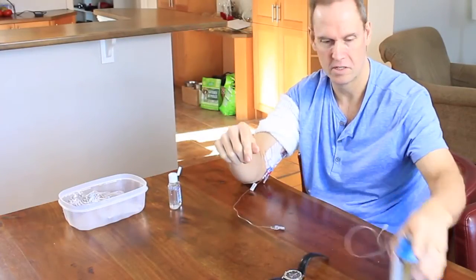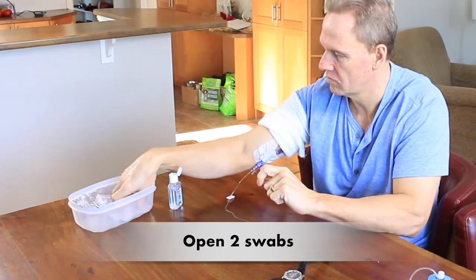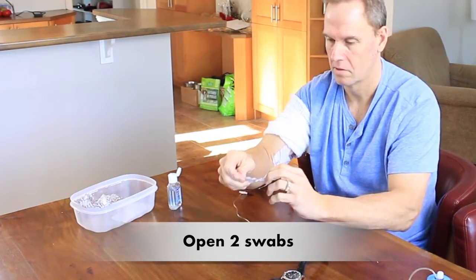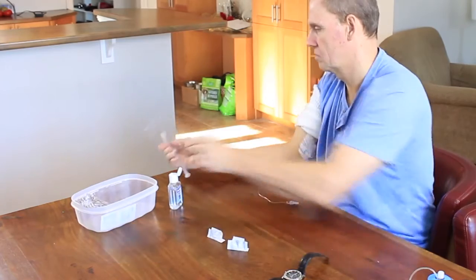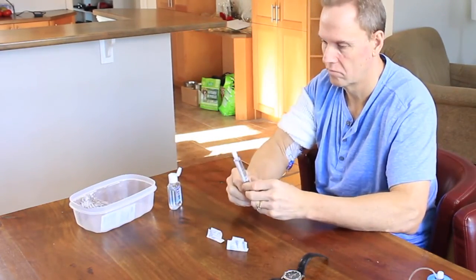Now you need to rinse the medicine out of your IV. So open the alcohol swabs. We're going to be flushing with two flushes, so we need two swabs. Open the wrapper of your flush. Remember, you need to get that air out. So he's tapping it in case there's any air bubbles.